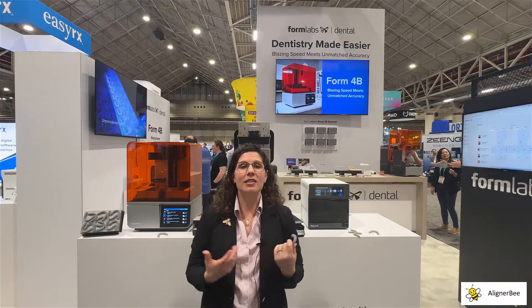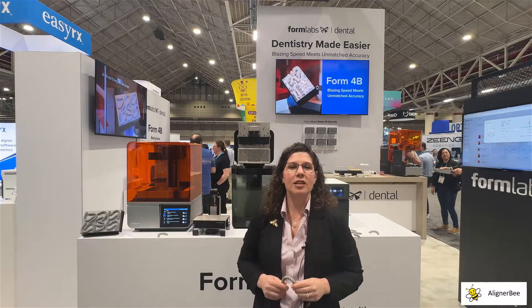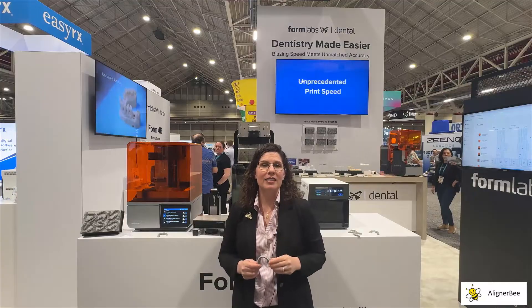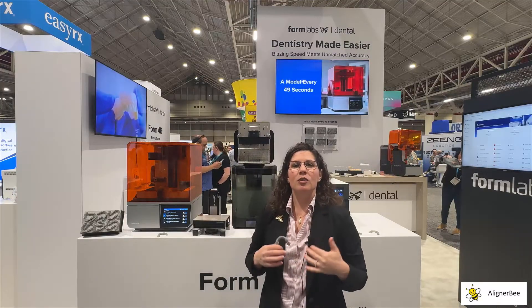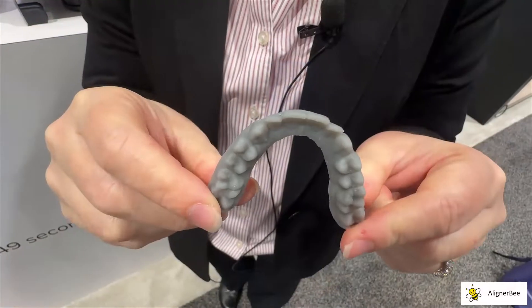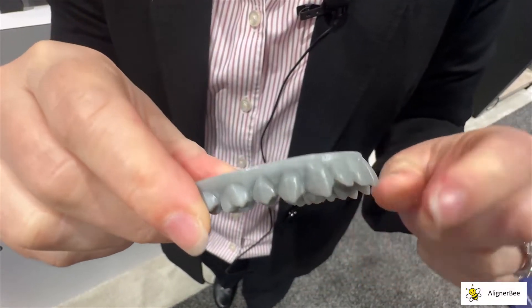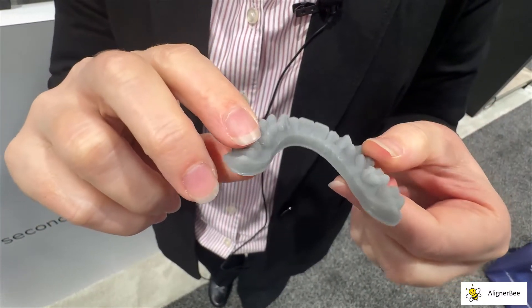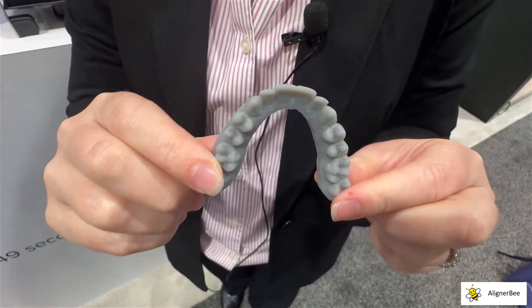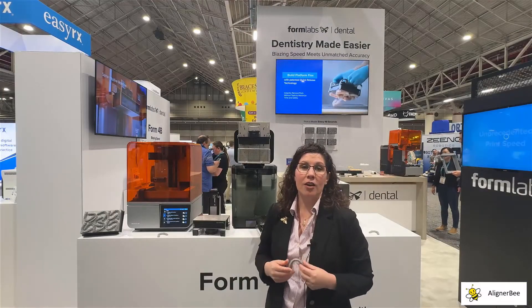As we can see, some great innovation here from Formlabs. With our assistant-driven workflows in our practice, our goal is really to train our team members so that they can undertake this process for us. With the new eight-minute print time, we're able to run a more efficient laboratory that uses less assistant time, so we can dedicate more time to the clinical space and to aligner or retainer fabrication.